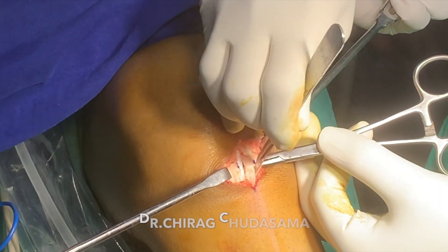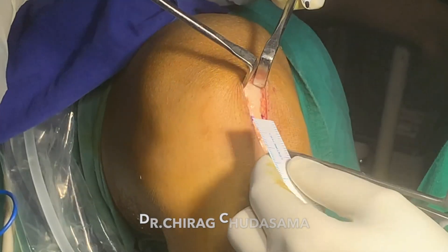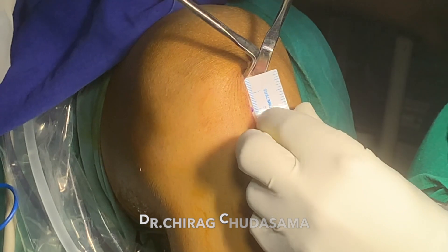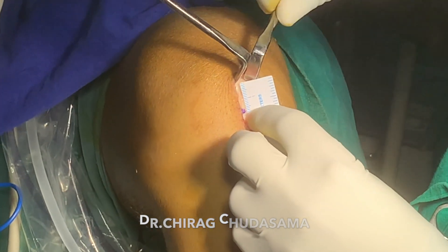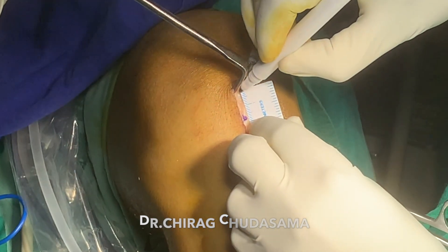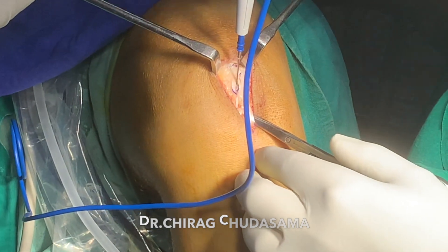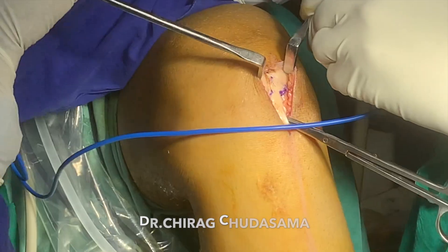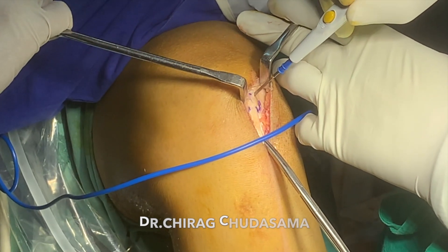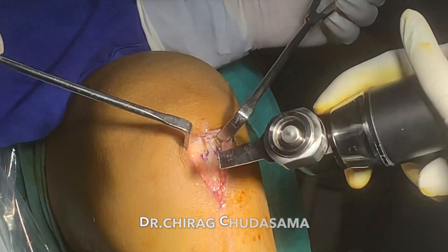After marking the patellar tendon harvest width, we split the tendon on both sides using an 11 no. blade. This is the mobile window of skin, which is retracted proximally to identify the patellar tendon bone plug side. The patellar tendon is marked longitudinally — it is 2 cm in length and the width is the same as the patellar tendon graft harvest width, that is 1 cm.